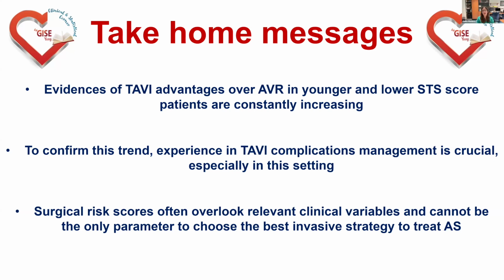Thank you, Roberto. And moving back to cerebral protection, Martina asked if in this case of young patient with calcific aorta, we can use, or we should use cerebral protection. Yeah, we said it. Yeah, absolutely, yes.